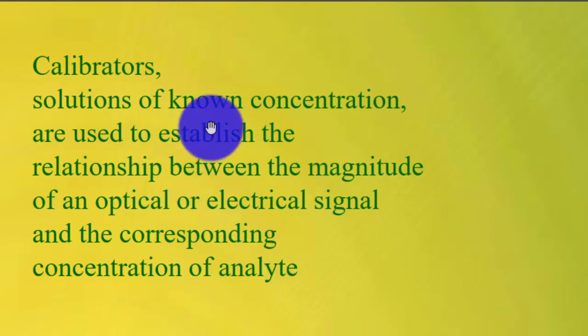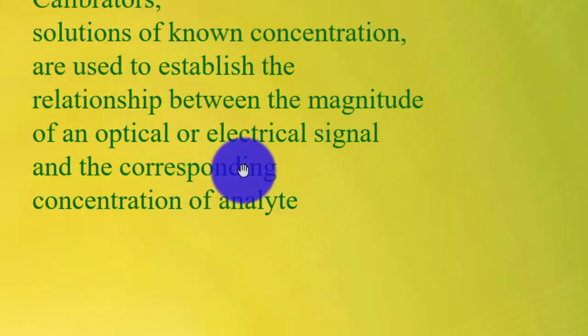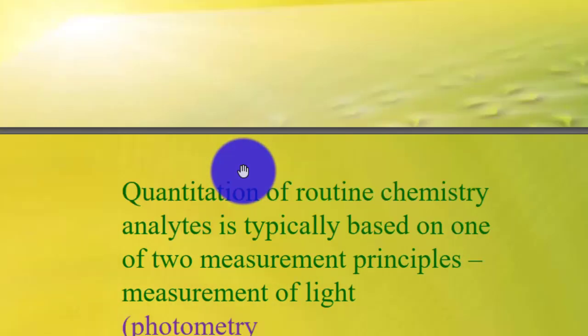Calibrator solutions of known concentration are used to establish the relationship between the magnitude of an optical or electrical signal and the corresponding concentration of the analyte.